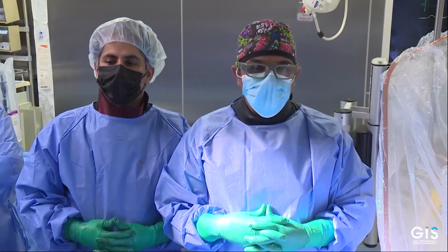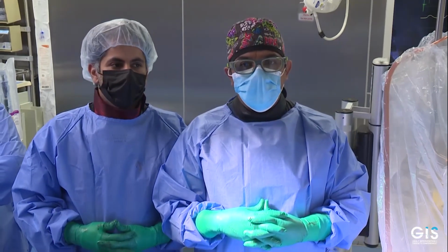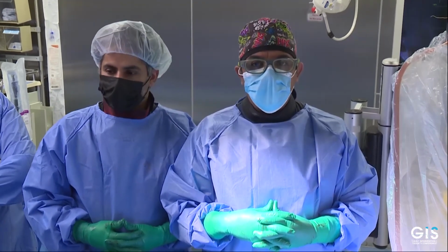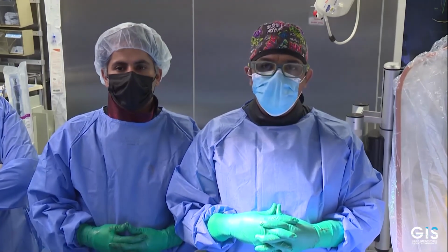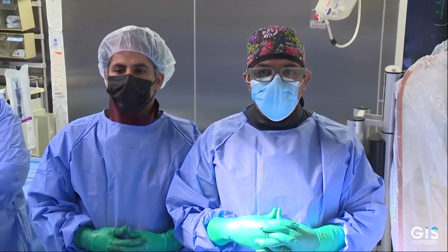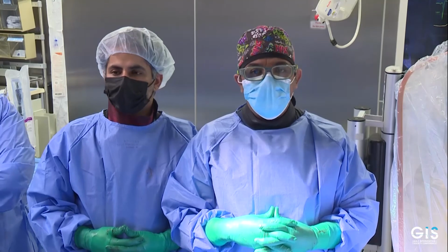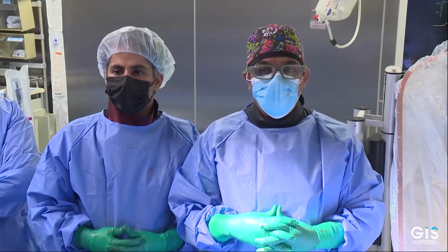And lastly, that we still can do most of TAVI cases with a single ProGlide approach, and as we showed you, there was no significant complication from that. The case went well throughout despite having all those difficulties, and the patient remains stable, and she will go back to CCU for recovery and likely will be discharged home tomorrow with no need for pacemaker so far.